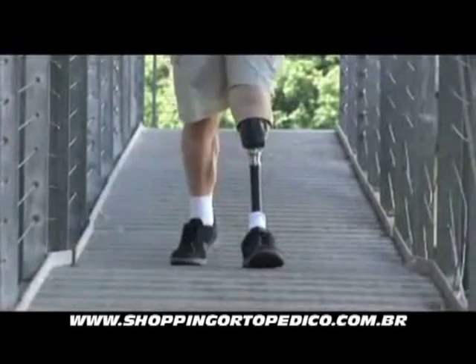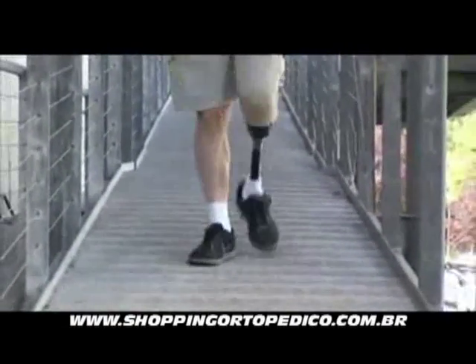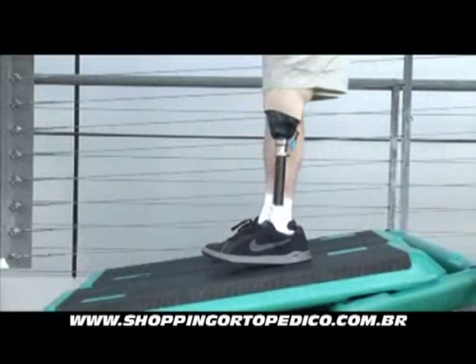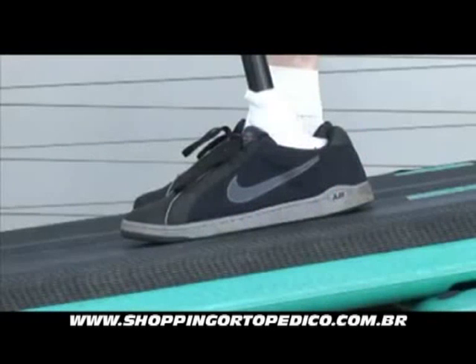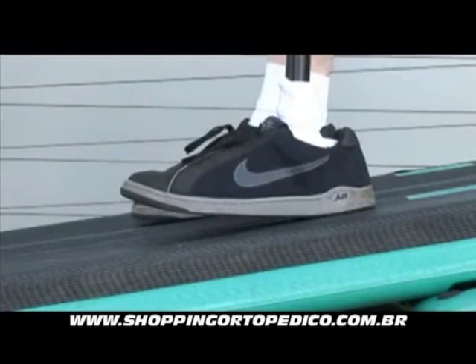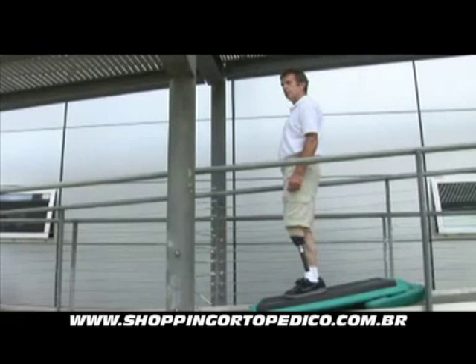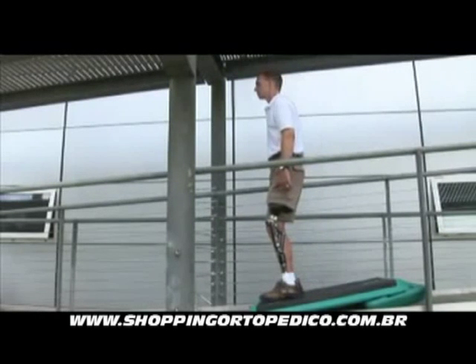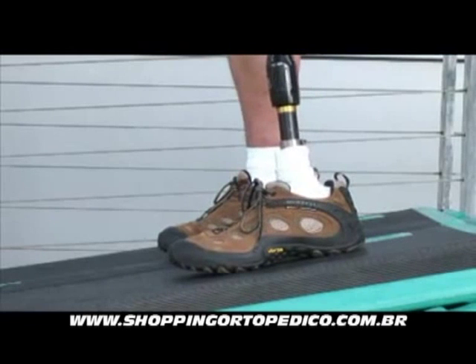A conventional foot forces the leg to one position. This can be optimised for walking on the flat, but it would not adapt to an incline and will force an unnatural posture, stressing the rest of the body. We can see with this conventional foot that the body is swaying from the hip to maintain balance on this incline. But the posture is straight with Echelon, translating into easier and stress-free walking on a variety of slopes.